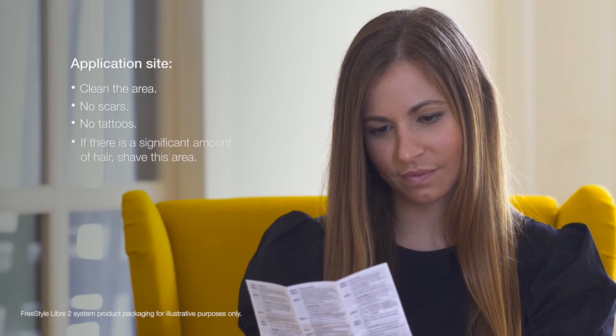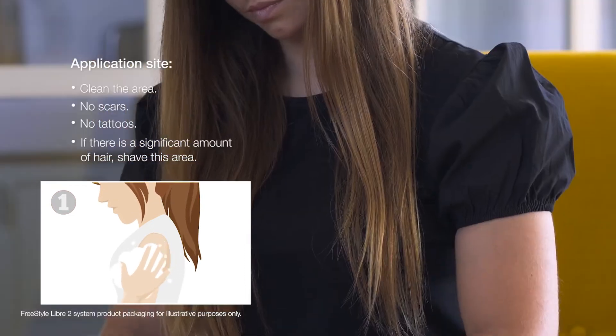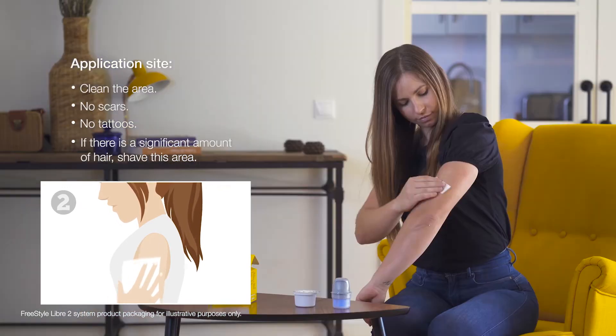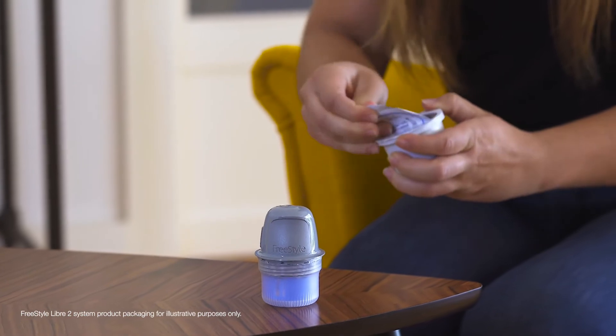Apply the sensor on the back of your upper arm. Select an area of skin that is protected to avoid snagging. Wash the application site with plain soap and water and dry. Then clean the area with an alcohol wipe and allow to air dry.